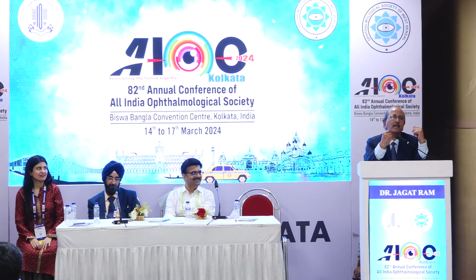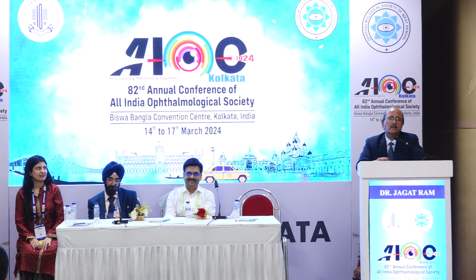They are used for that, and we use theirs. I think cauterization is extremely important, whether it is a vascularized posterior capsular membrane or a stalk. Both of them should be cauterized, otherwise bleeding will be there.